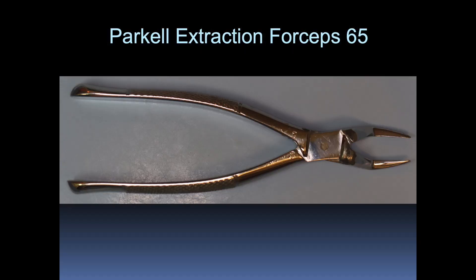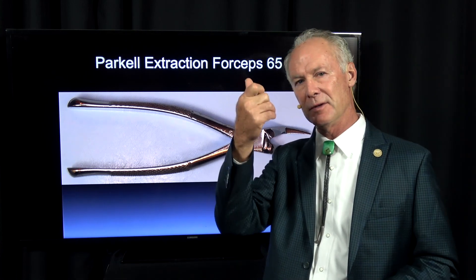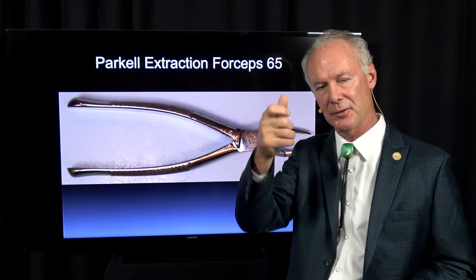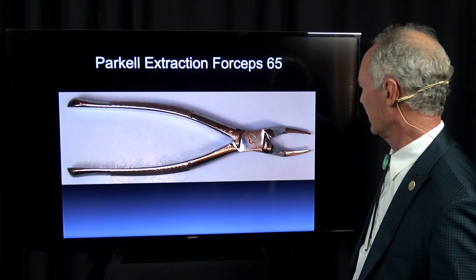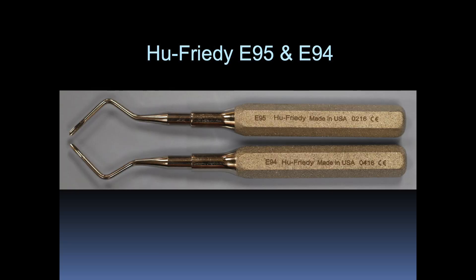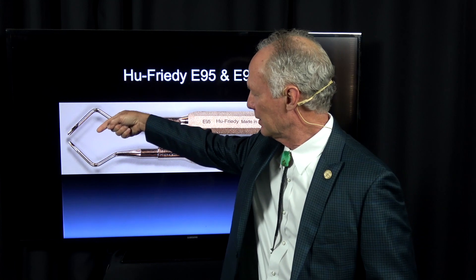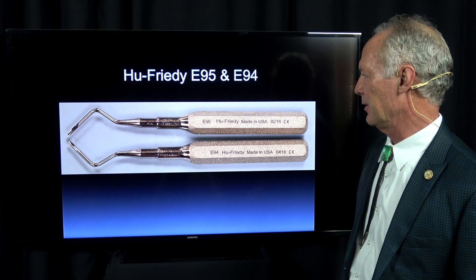This is a 65 — it's got these long, thin beaks. It's very good if you have a tooth that has a broken root and you've got to go up sub-alveolar crest and unscrew those roots. This is good for getting something small because these beaks are thin and long. This is a 42 and a 79 — these are like a 150 and a 151, just a little different design. And these elevators are very good if you've got a little root tip or a little piece of a tooth down in a socket; one goes this way and one goes this way and you can elevate. They're very handy for elevating those little tips.